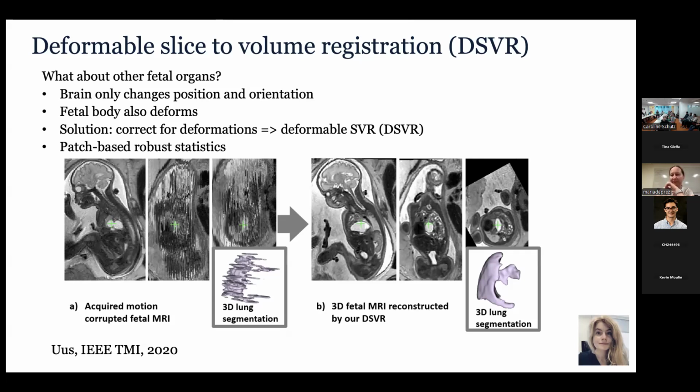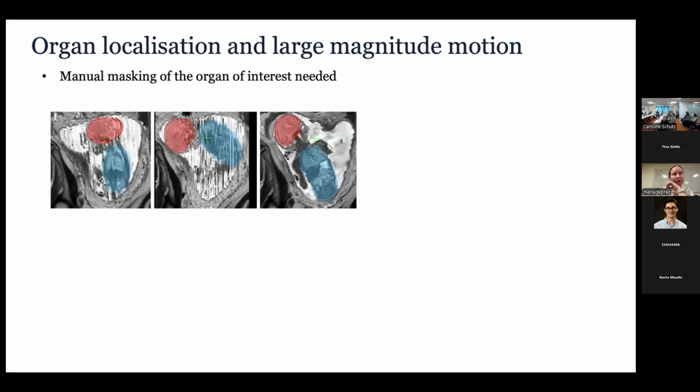So we have, I'm going to talk about that now, a deep learning wrapper. I mean, partly deep learning, partly not. I didn't put all the details. Alena has a Docker where there are more pre-processing steps. So we are looking at the amount of motion within the stack and trying to find out which one is the best and which one we should use. Also registering everything together and then trying to see which one fits better, like with cross-correlation. So there are a few simple pre-processing steps, but they can go a long way in full automation of this process.